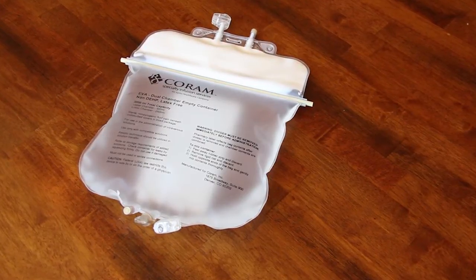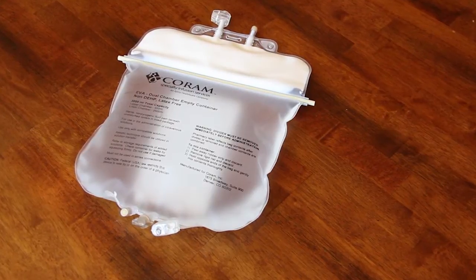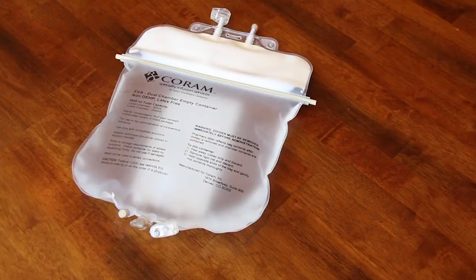If you notice that any of this has happened, do not use the TPN bag and call Corum. Save the bag for Corum to pick up and replace.